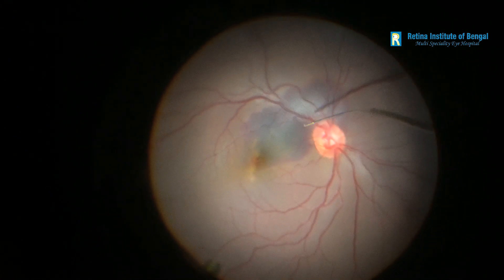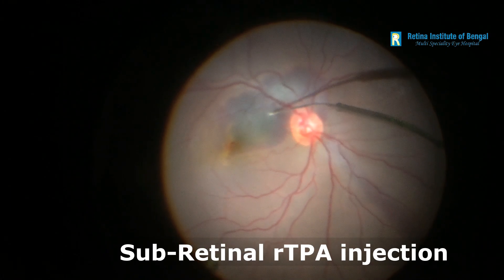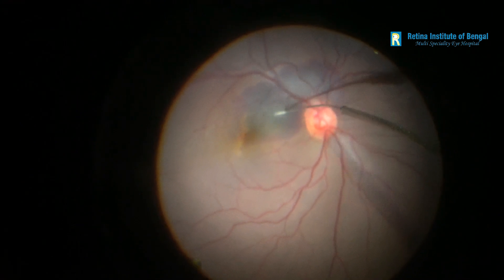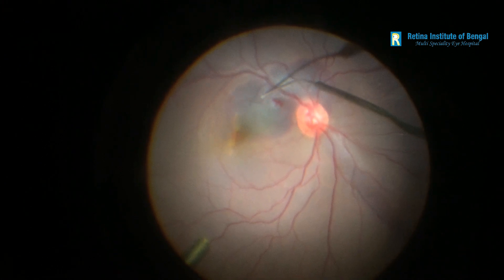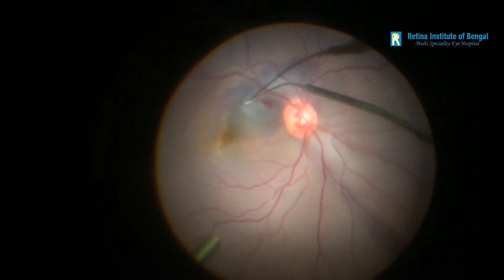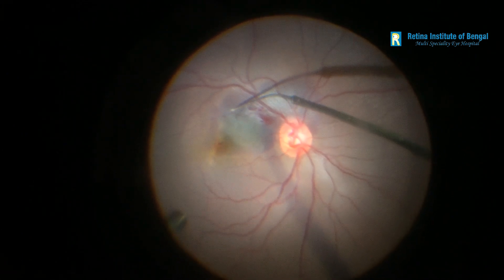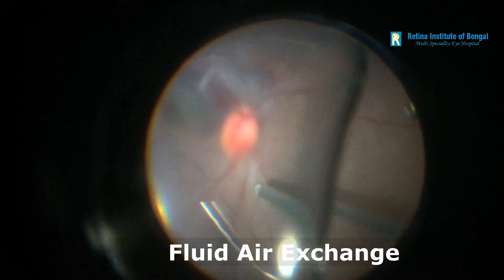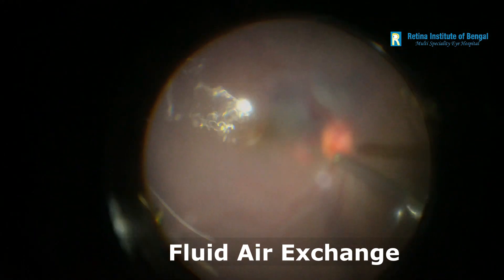Once the posterior hyaloid had been separated from the retina all around, we proceeded with completion of the vitrectomy. Having removed all the vitreous, the second challenge remained — that of the sub-retinal blood. Using a 40-gauge sub-retinal needle, we injected a cocktail of recombinant tissue plasminogen activator and air under the sub-retinal space. This is done in small aliquots in multiple spaces all around the area of the sub-retinal blood. Once that had been done, we did a fluid-air exchange and filled the vitreous cavity with SF6 gas.